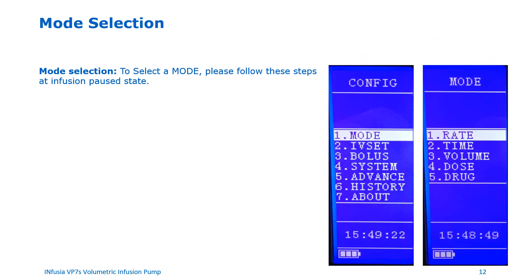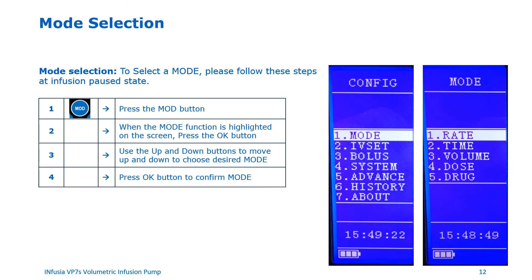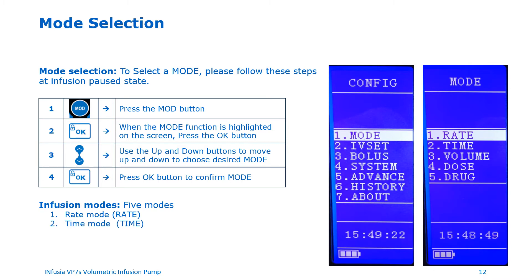Let's discuss mode selection. Please note the infusion must be paused for mode selection to be available — you cannot change a mode when an infusion is running. To change mode, press the menu button, then when the mode function is highlighted on the screen, press the OK key. Use the up and down buttons to choose the desired mode and press OK to confirm. There are five infusion modes: Rate Mode, Time Mode, Volume Mode, Dose Mode, and Drug Mode. The Drug Mode comes with a pre-populated set of drugs; however, we do not recommend using this mode for veterinary use as the drug library is rigid and cannot be configured for different dose rates.